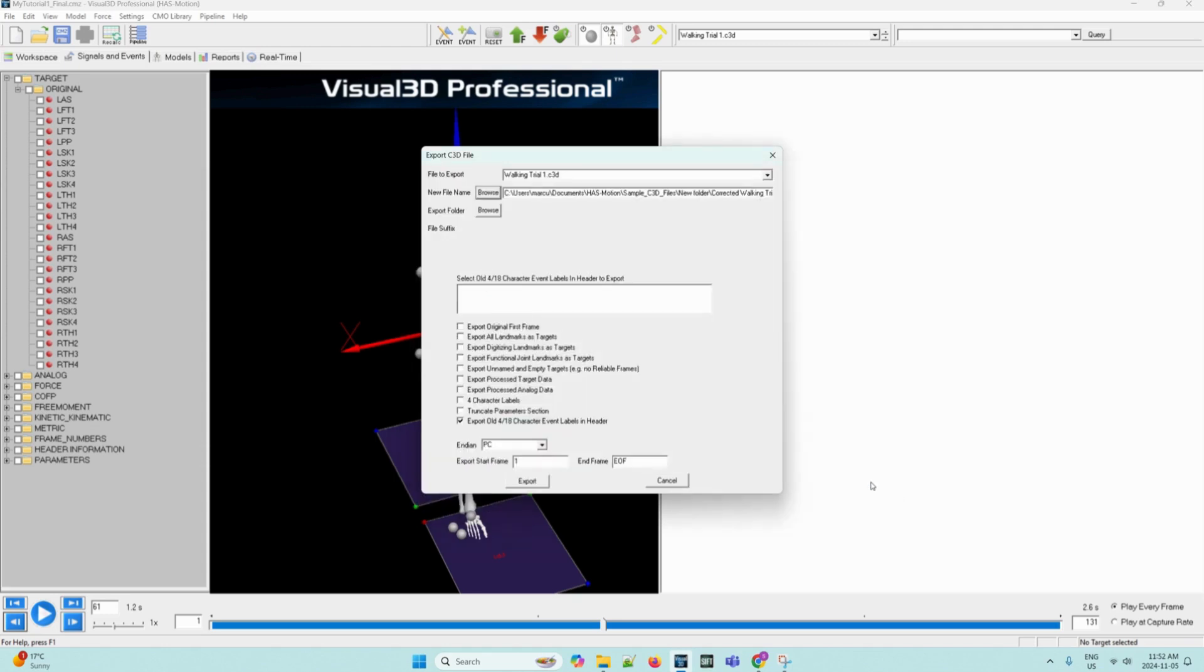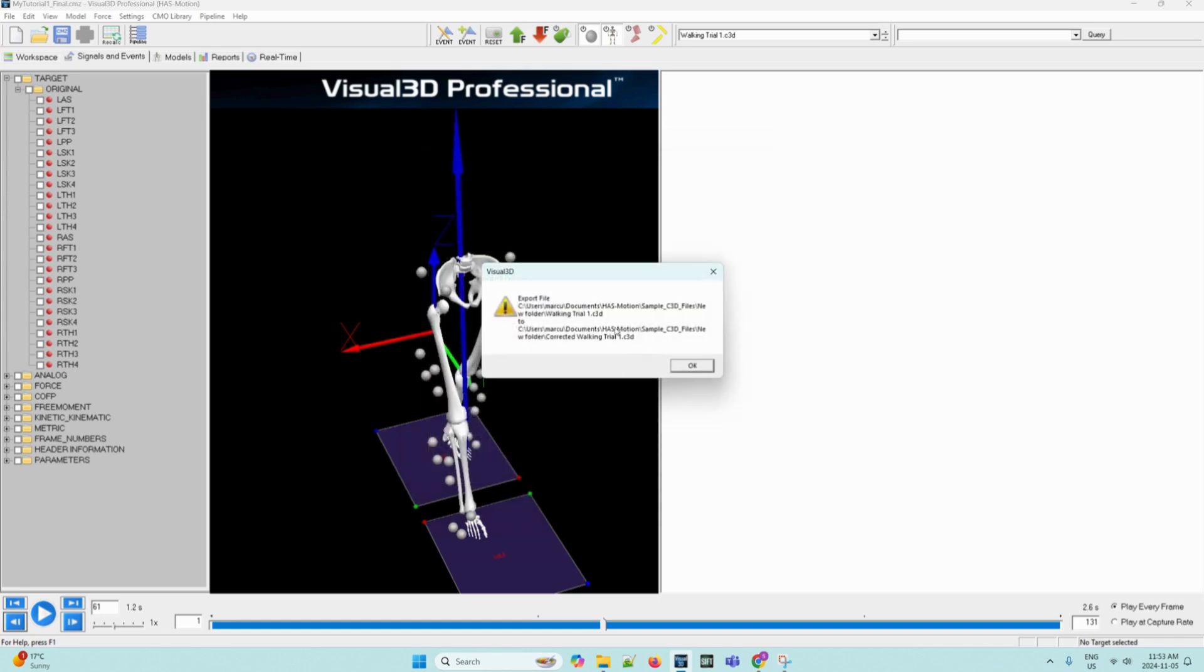A quick note, it is permissible to overwrite the existing file, but it is good practice to keep your original data intact, so we recommend choosing a new name. After we've clicked Save and come back to the dialog box, we can click Export. This will show that it has exported the file.